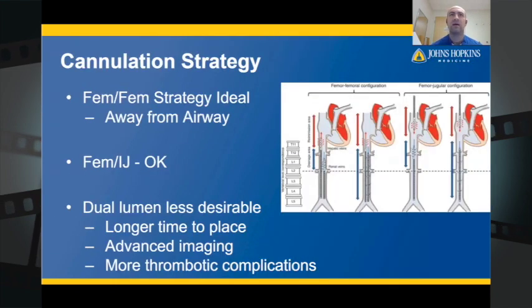So as mentioned previously, there are several cannulation strategies, of which the two recommended approaches are represented on the right. The femoral-femoral or the femoral internal jugular configuration can be used. The femoral-femoral approach allows for more rapid surgical field preparation, creates efficiency in movement around the bed, and keeps the operator away from the patient's airway. A large multi-stage drainage cannula and a single return cannula are what has been proposed as most effective.